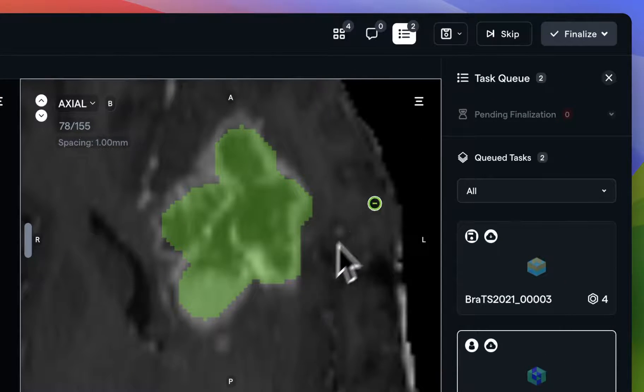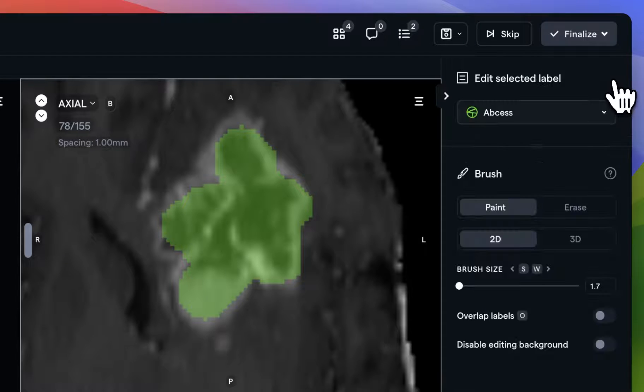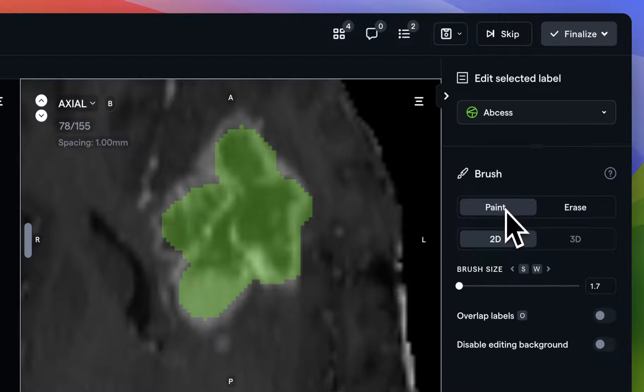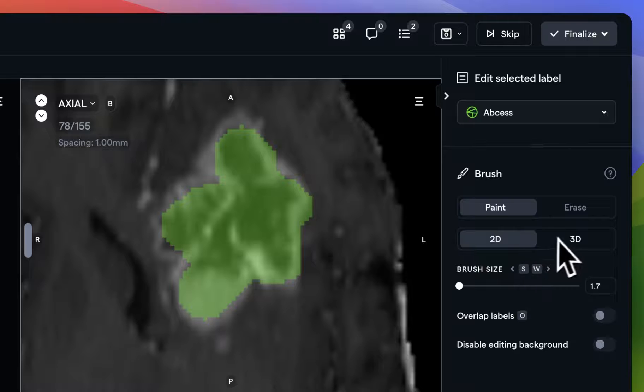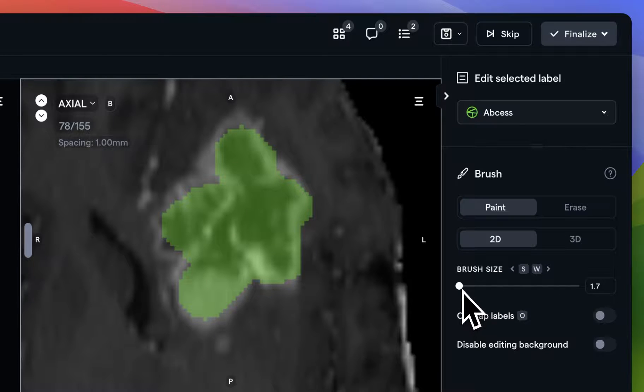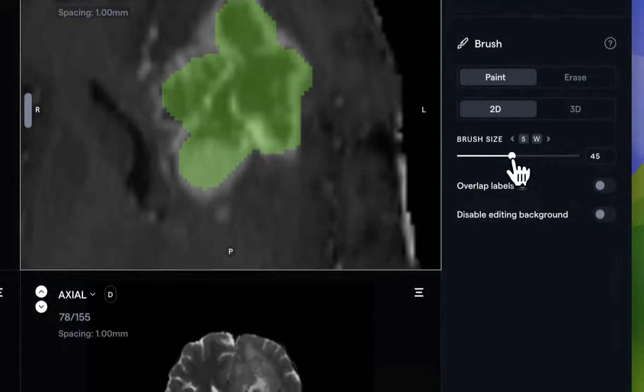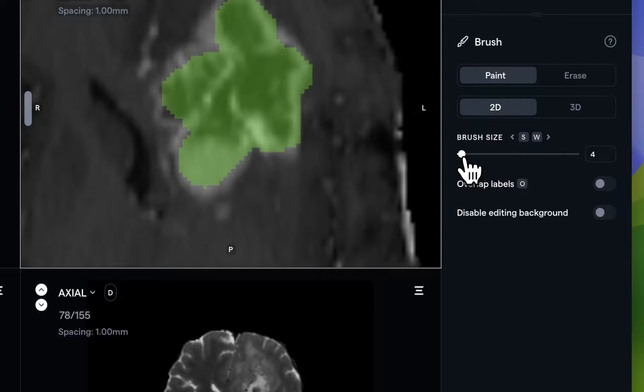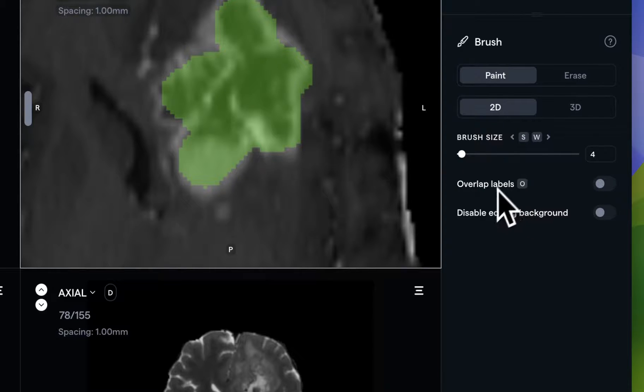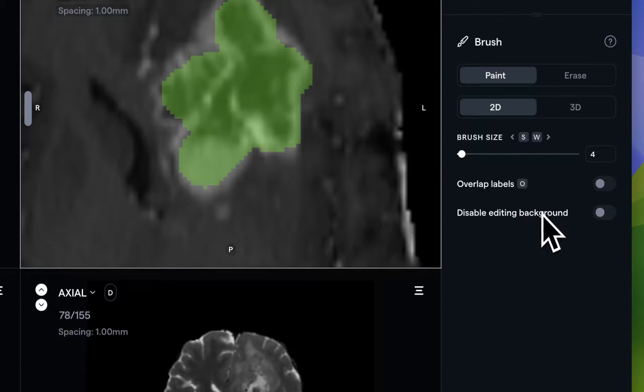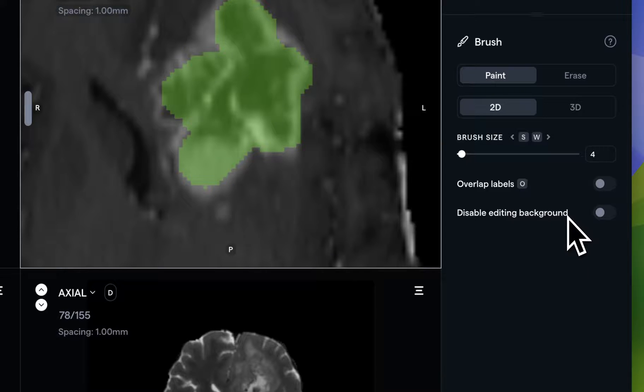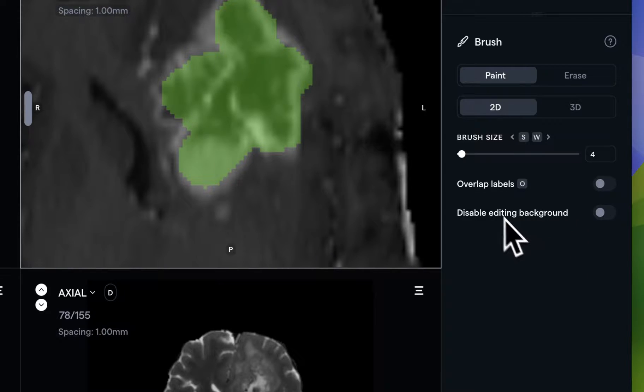The right-hand context panel also contains several simple settings, such as paint/erase, 2D and 3D mode, as well as brush size. If you'd rather use a slider to control the brush size, you can. You can also choose to enable overlapping labels, or disable editing the background, if you'd like to really control the operational area in which you're doing your work.